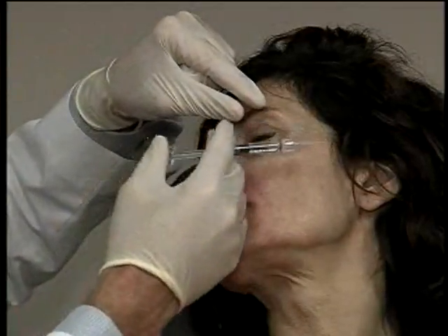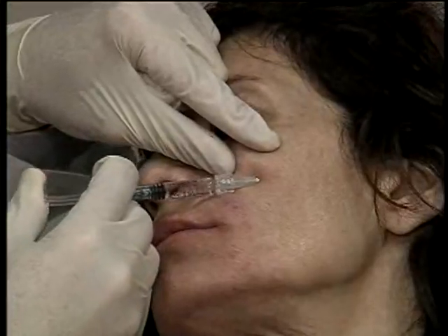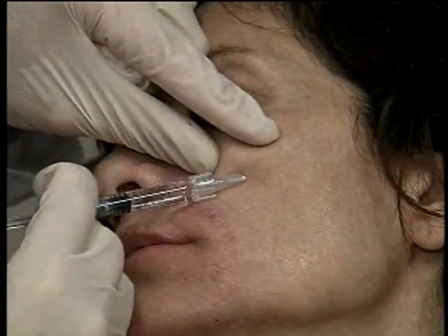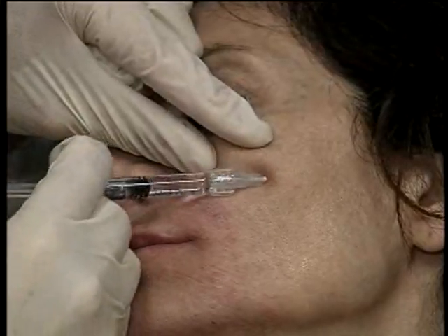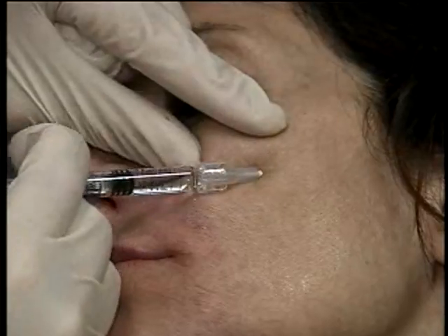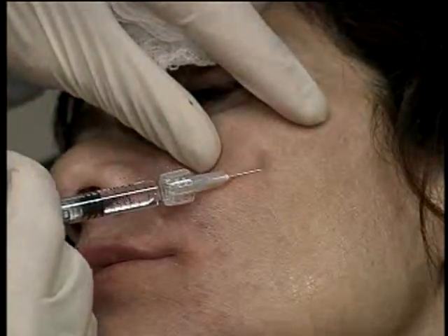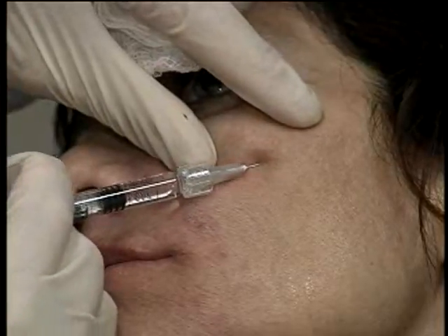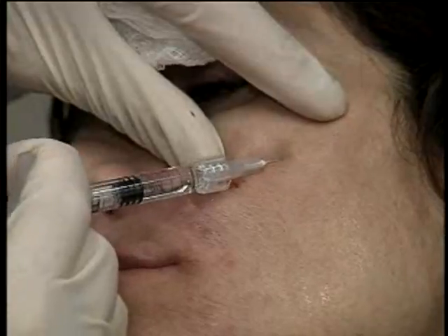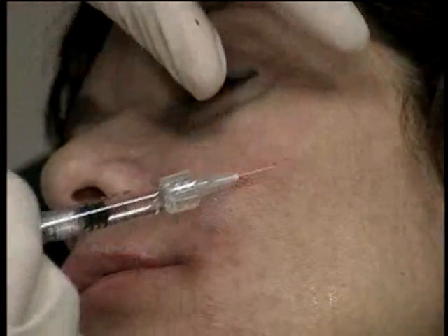And I know the area I want to treat is this area, so I'll come into here and I use a fanning technique. Once again, slow and purposeful movements, consistent amount of pressure on the plunger as I fill in this area. Now this can produce a significant amount of bruising, so I do want to go slow in this area as I fill in this area. Massaging along the way.